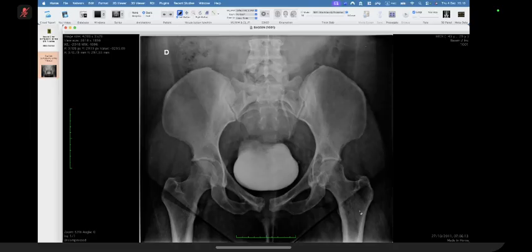Let me tell you something more importantly. Patient is only 29 years old. I'm reviewing my findings again. Yes, please do. Thank you. 29-year-old. Yeah, 29-year-old.